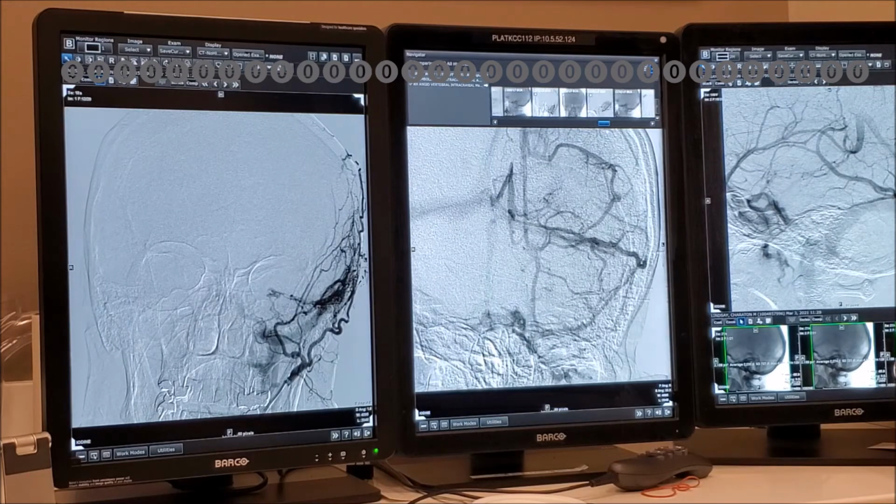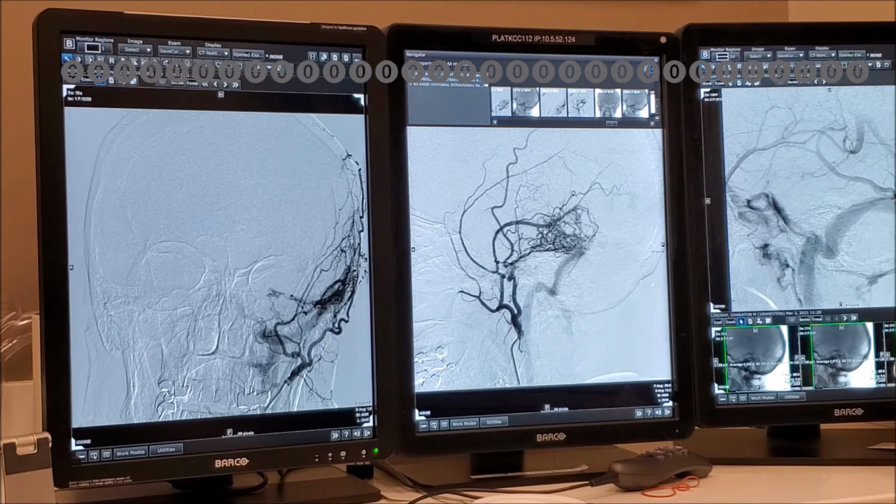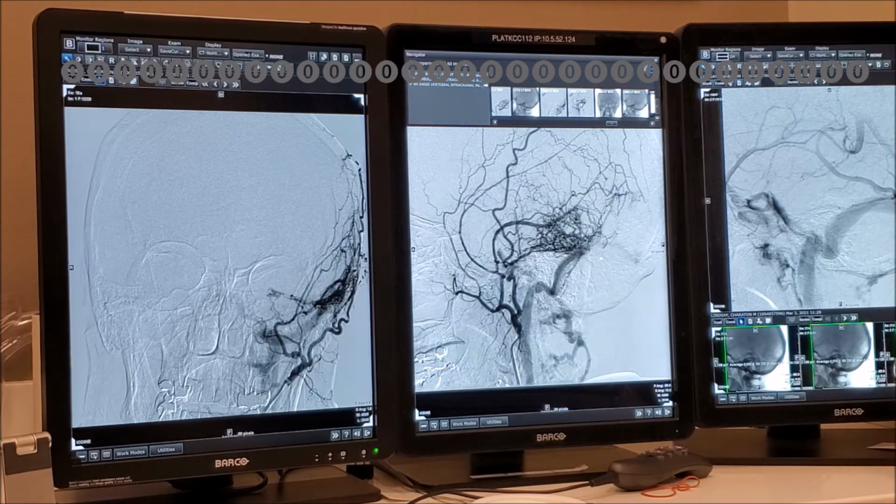My question, Dr. Berenstein, based off this is, can you ascertain that the left transverse sinus is patent throughout its length, or would you conclude from the images you've seen so far that the left transverse sinus at the fistula point is occluded? Yes, there's something wrong with that sinus. But can you tell me that it is patent throughout? I don't think it's patent. Alright, that's what I thought too. But I would look at the MR. I think the MR should help, but you don't have an MR. That's right. Non-contrast and contrast MR should help you.